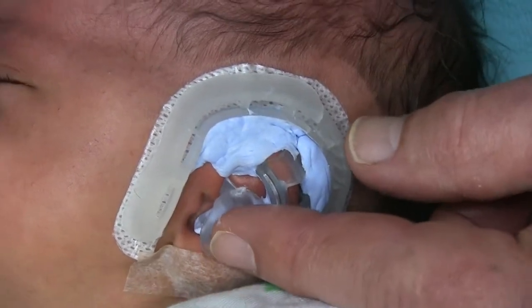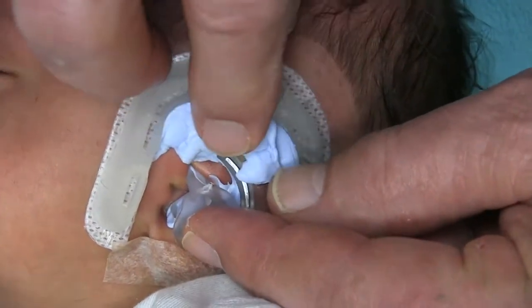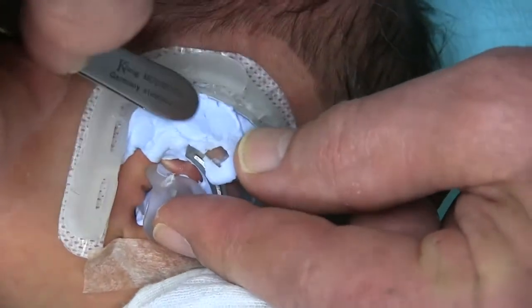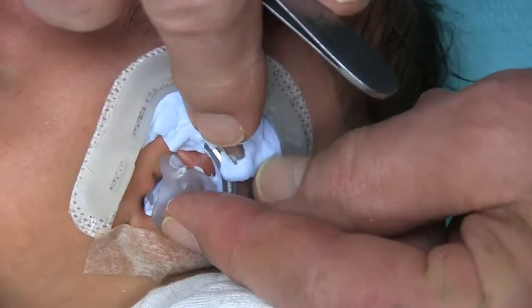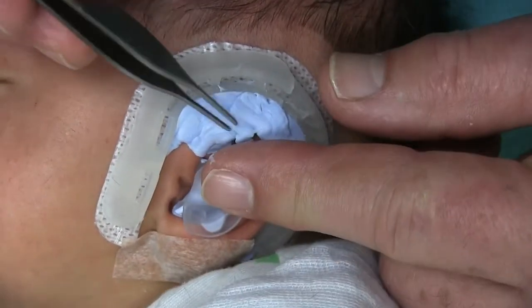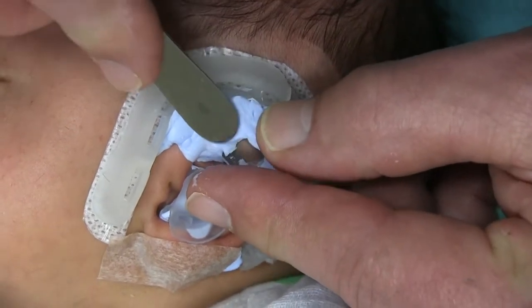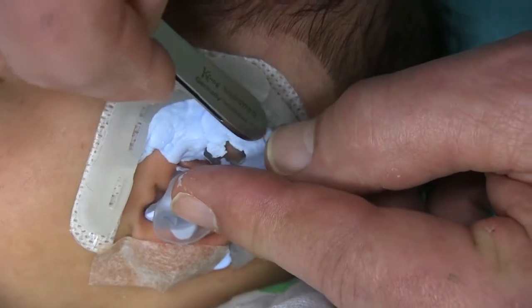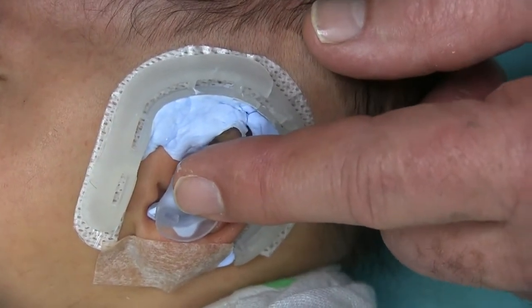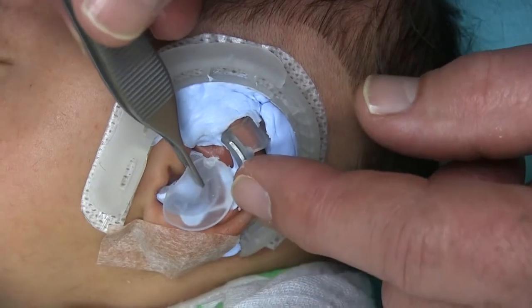Lock this thing in maybe. I'm going to have to pull that off and redo that. I'll just brush that. It set up pretty quick — that's the thing, it's a dance with this stuff. Let's see how this concha is done. Let's see if we've got a good moulage with that.